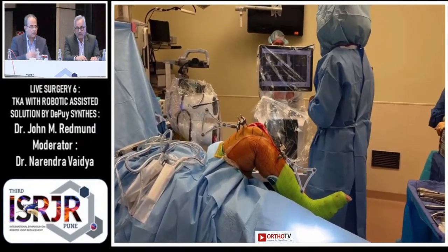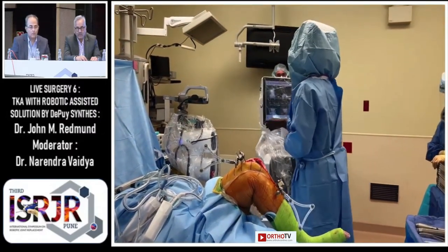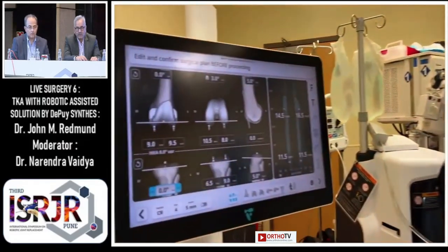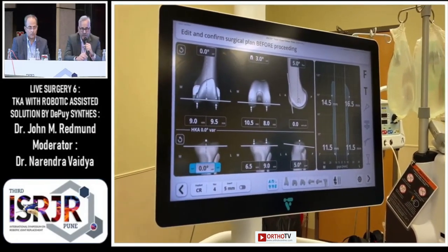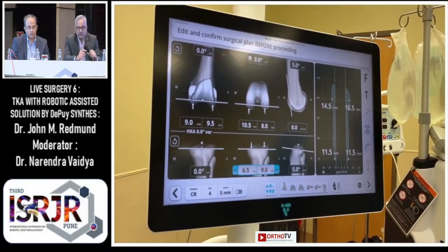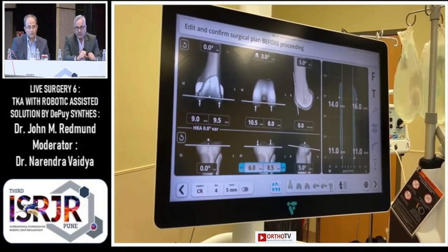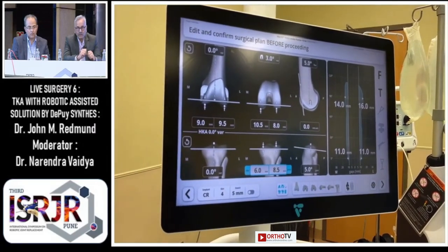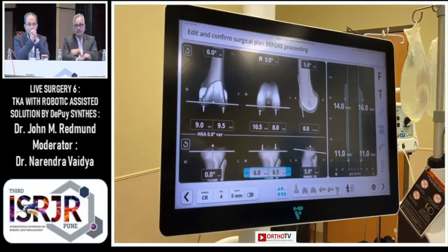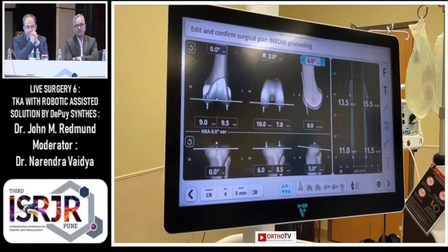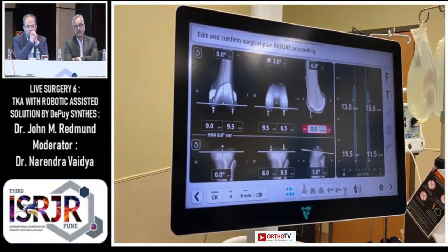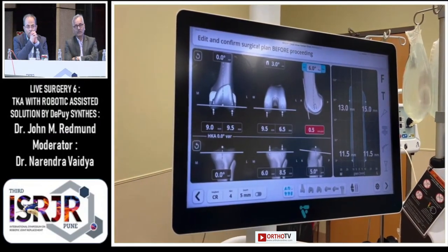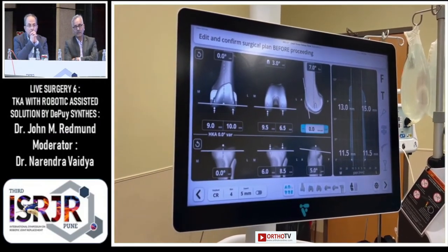There is a draped-sterile monitor that the surgeon uses, and also a monitor on the far side of the room that a representative can use to help control implant positioning. The system's footprint is quite small — it was designed so that in a very small operating room, you can attach the robot to the bed and wheel the cart out, leaving essentially just one camera and the robot attached to the bed with almost no footprint.